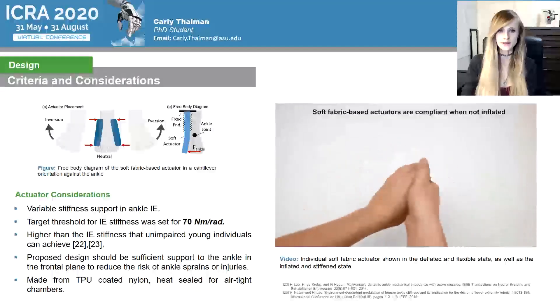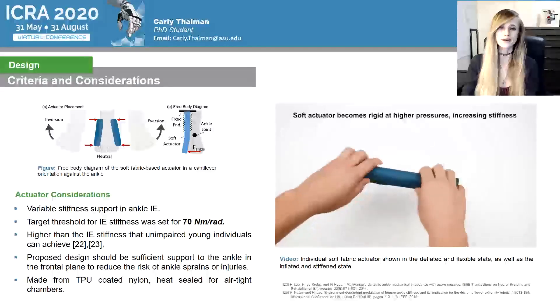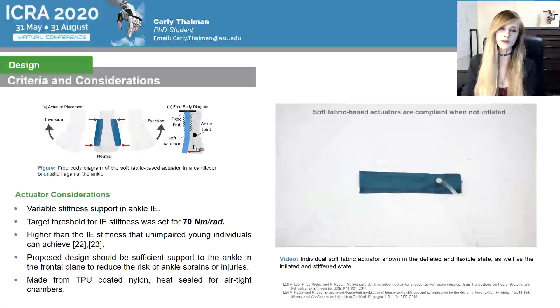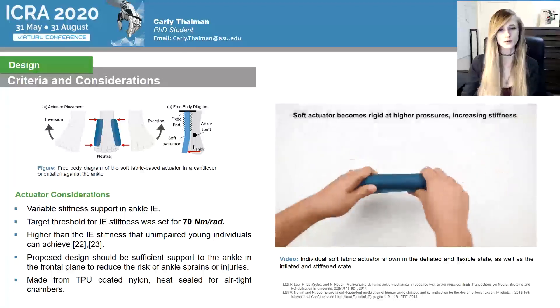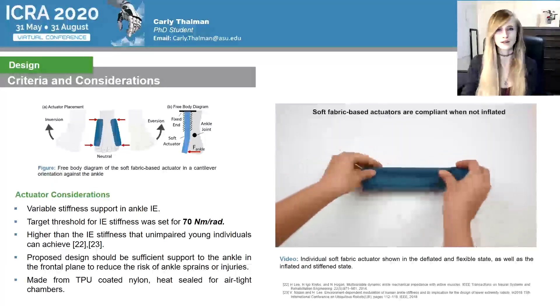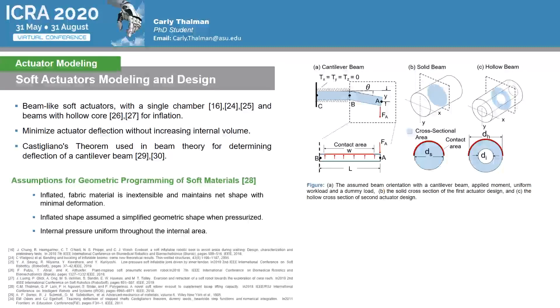The target threshold for IE stiffness was set at 70 newton meters per radian, which is significantly higher than what can be achieved by unimpaired young individuals with the highest voluntary contraction of their ankle muscles. The actuators were fabricated using a single rectangular sealed pouch which was folded in half lengthwise and sewn along the outside of the heat seal to form a closed loop. When inflated, this loop forms a hollow cylinder that behaves and looks similar to a blood pressure cuff commonly seen at most doctors' offices. Previous studies have shown successful applications of beam-like inflatable soft actuators. The presented actuator design aims to minimize actuator deflection without increasing the internal volume, modeled using geometric programming of soft materials.